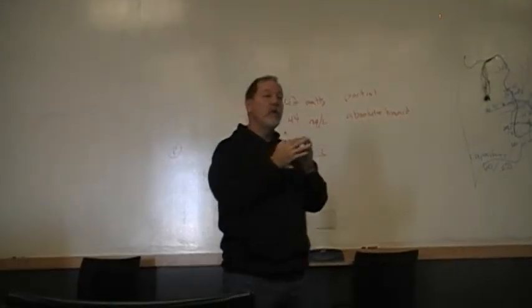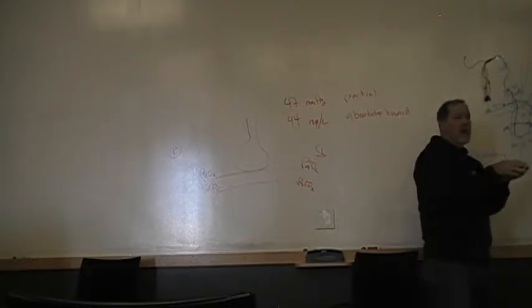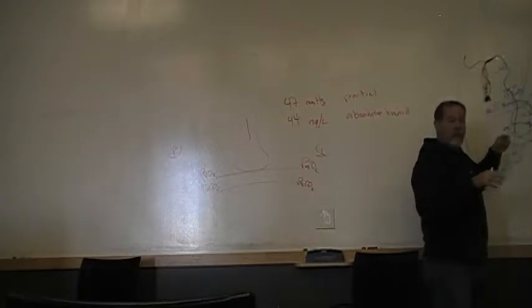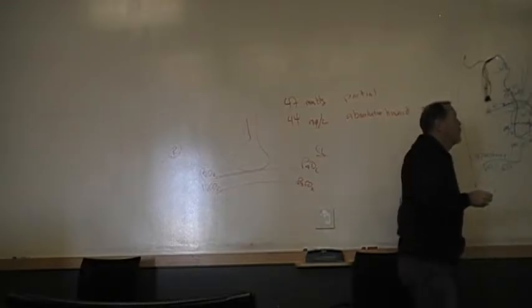So if I occlude the opening to this blood vessel, I've inserted the balloon far enough that eventually in the lungs, the airways become smaller and smaller and smaller, right? Well, the blood vessels also become smaller and smaller and smaller, and eventually the balloon is going to occlude the vascular wall of that blood vessel.